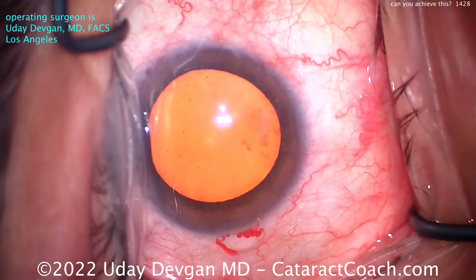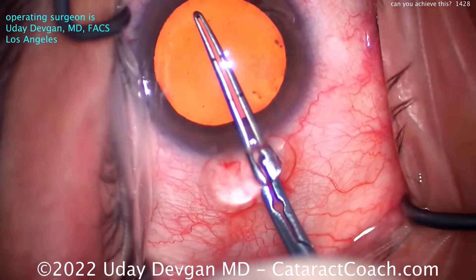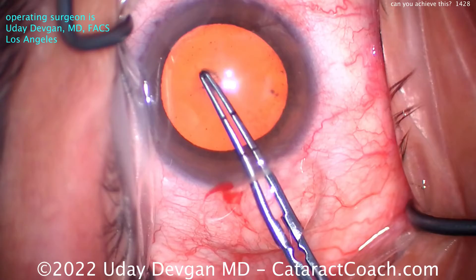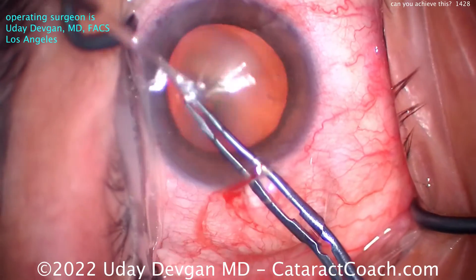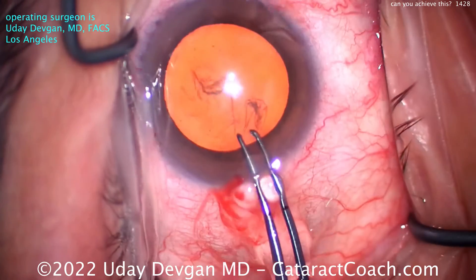So here's that case. It's pretty routine. We're going to show it to you from the beginning all the way to the end. In this case, I've obviously done many, many thousands of cases, so I'm well beyond case 1,000. But if you can get anywhere near this level by case 1,000, you're really doing great.